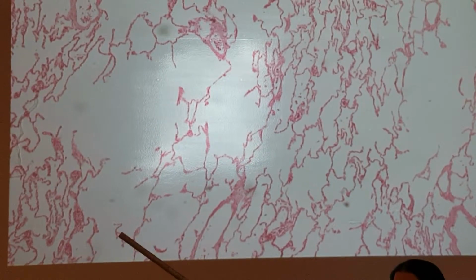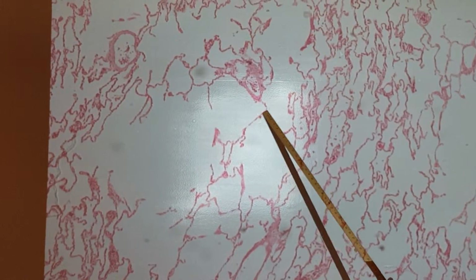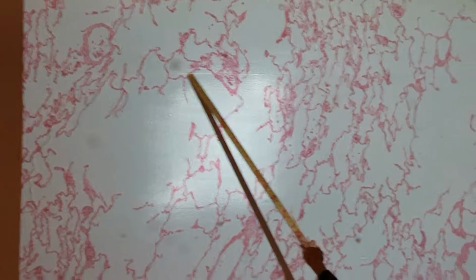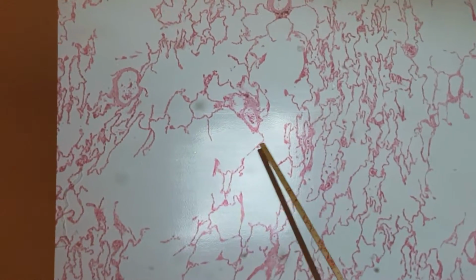We did the visceral pleura. So the other two things we have are the type 1 and type 2 cells. We're not going to get close enough to see if they're cuboidal-like or simple squamous-like. So instead, we're going to do it by how they surround the alveolus. If it's just in this single line, single wall of an alveolus, that's where you're going to find the type 1 cells. So anything that makes up the wall of the alveolus just by itself, type 1.